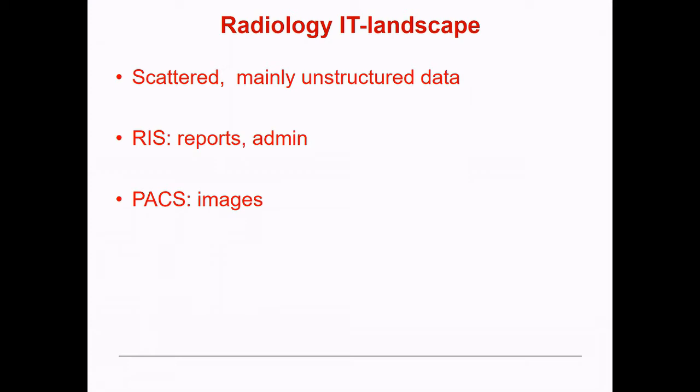And it's described in a text that is at best referring to the slice. You know, the whole data is kind of sliced up. So you have a very weak correlation of what is in the text and where it is happening in the image. And measurements are rarely done in clinical practice. Although there are a lot of scores that depend on measurements, they are either guesstimated or, well, not reported, because it's extra work to draw a line here, draw a line there. So if there's not a lot of pressure on me to provide this line, I just don't measure it.